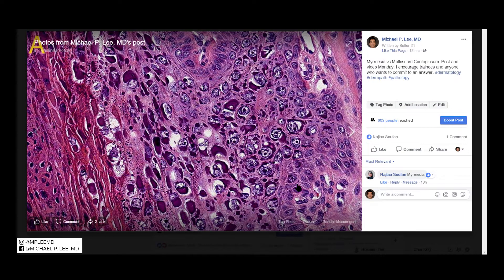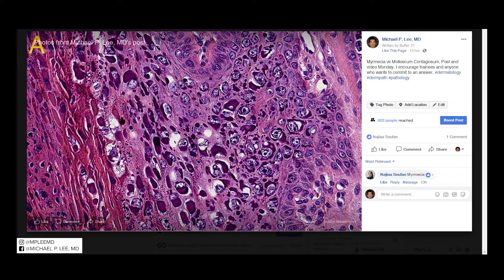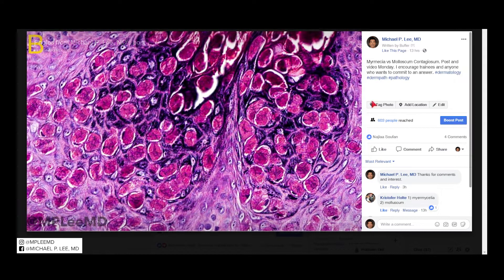Good morning, this is Dr. Li with another daily episode of DermPath Made Easy. This was a case that was requested by someone who posted in the comments. For all those that participated in the unknown, this is myrmecia and this is molluscum. So let's start with myrmecia.